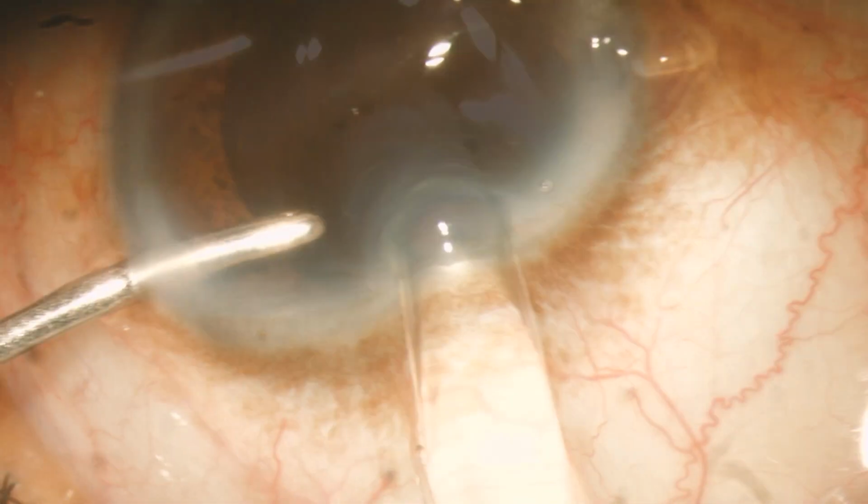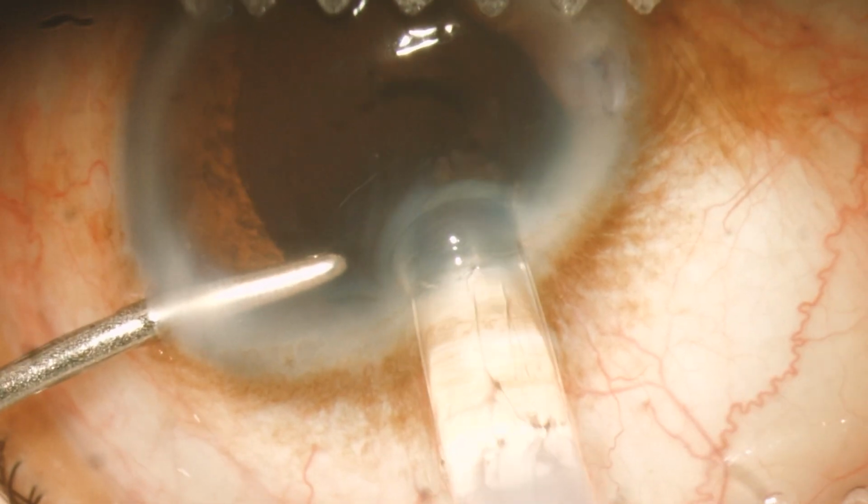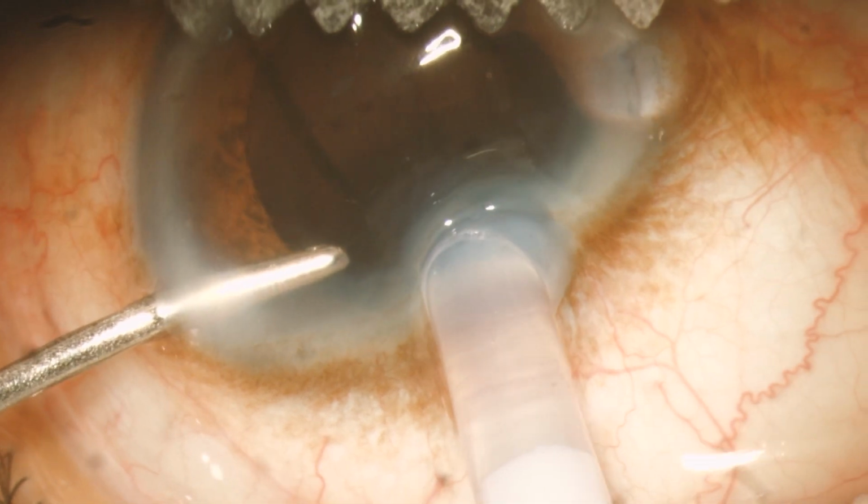vitreous push the posterior capsule anteriorly, proving that, like the Loch Ness monster, vitreous in cataract surgery arises when we are not prepared to see it.